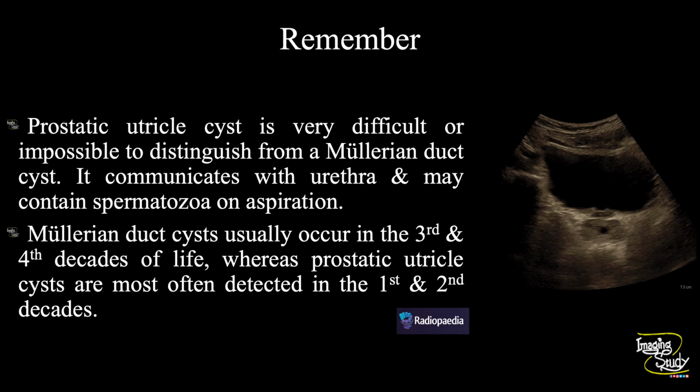We try to differentiate or suspect the exact diagnosis on ultrasound considering the age of the patient. If the age is first or second decade, we go for the prostatic utricle cyst primarily. If the age is around third or fourth decades like this patient, we usually try to focus on Müllerian duct cyst.